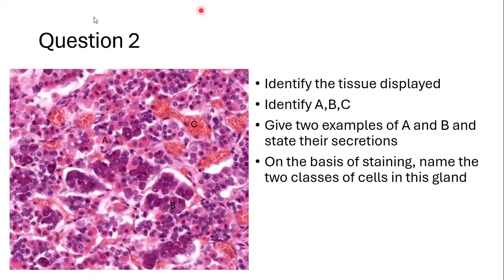I'm waiting for your answers in the chat box. Just put anything, we discuss it. Pineal gland, okay, I see. Martin is saying adenohypophysis. Okay, thymus, thyroid, submandibular, parotid. This is very good now. I like it when people have different answers. Now let the discussion, let the debate begin.